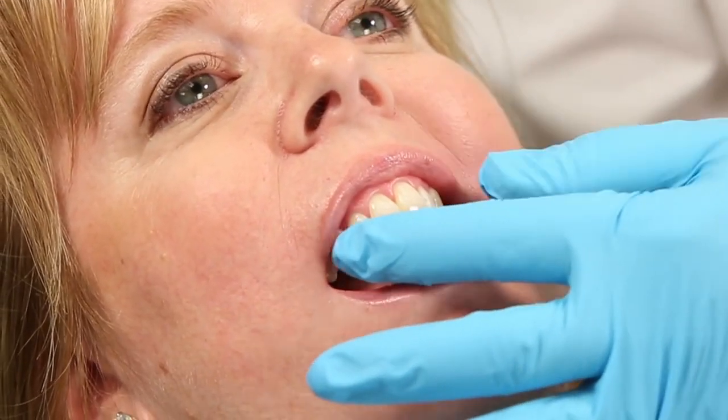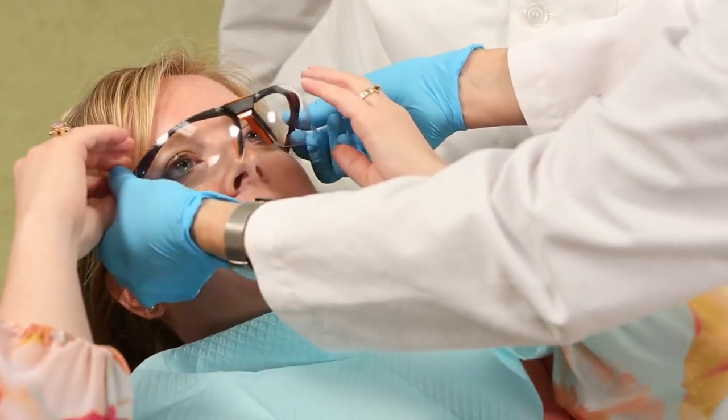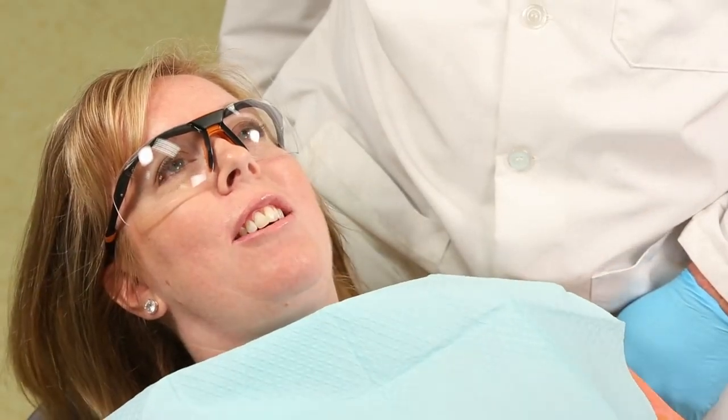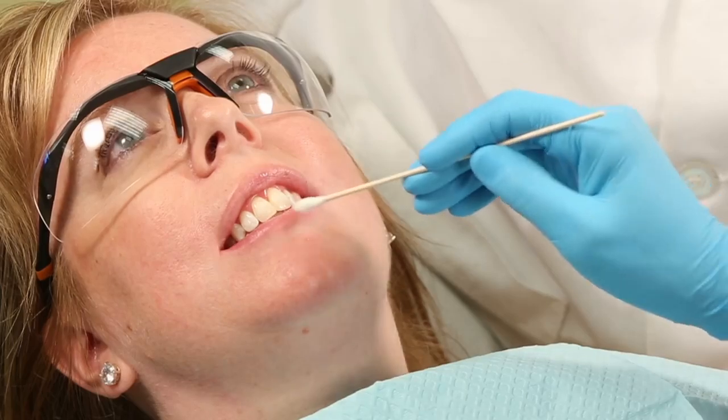Because of the hydrochloric acid contained in Opal Luster, isolation is extremely important. Also, both you and your patient should wear protective eyewear. For additional patient comfort, apply a lip emollient prior to treatment.